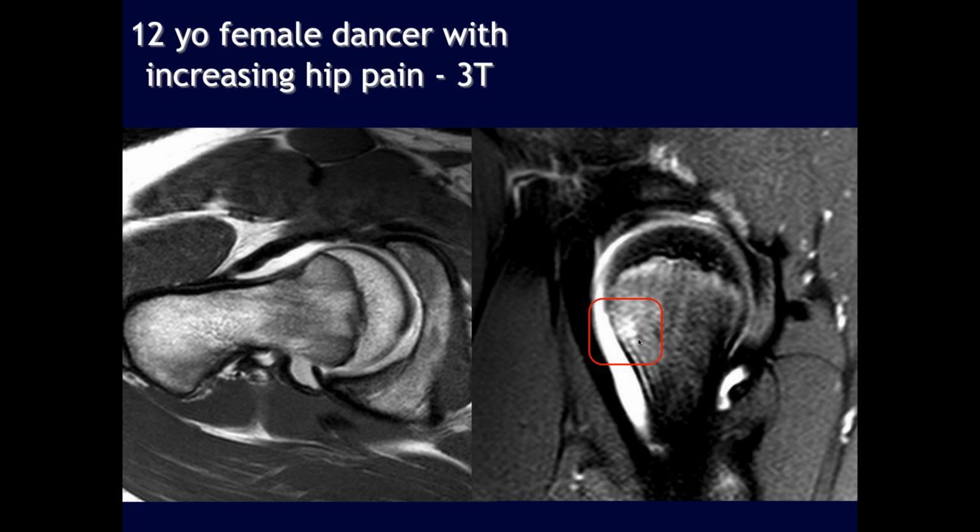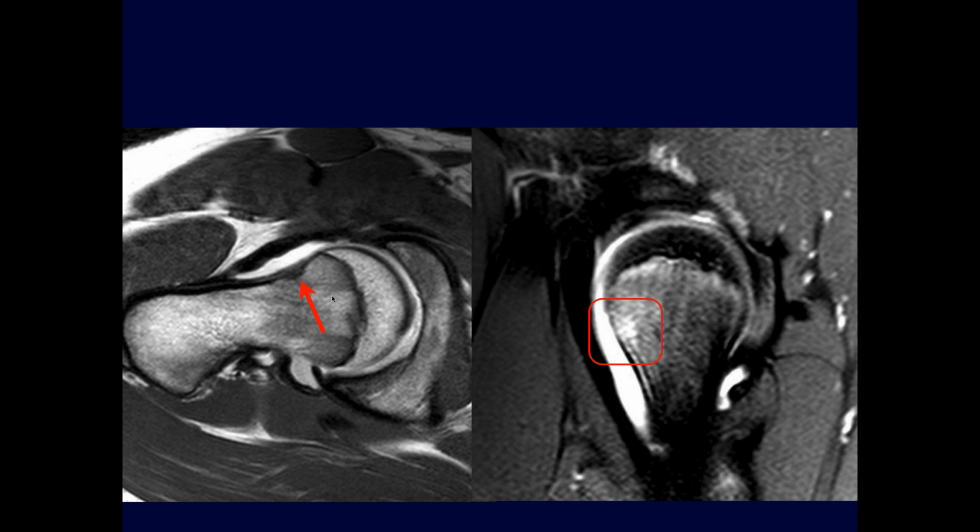And honestly, it doesn't look too aspherical. I think this is just normal morphology with a herniation pit and edema. What I was going to ask, John, is have these been measured for rotational abnormalities? Because if they get impingement at this age, there has to be something anatomically wrong, I would think.